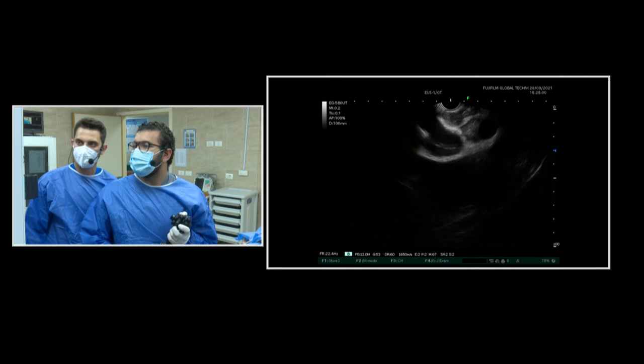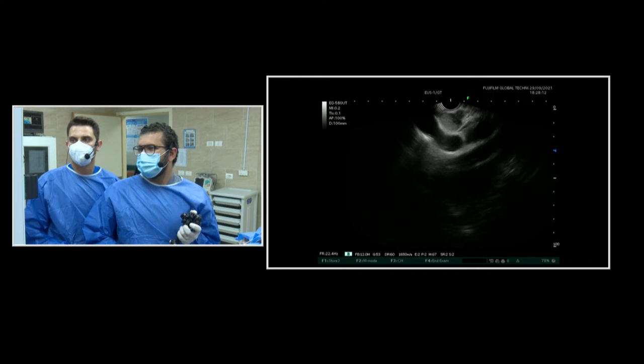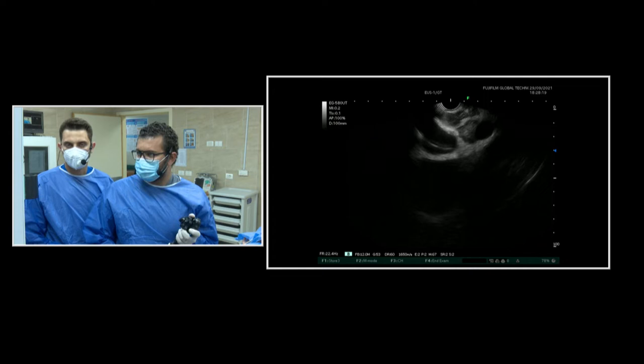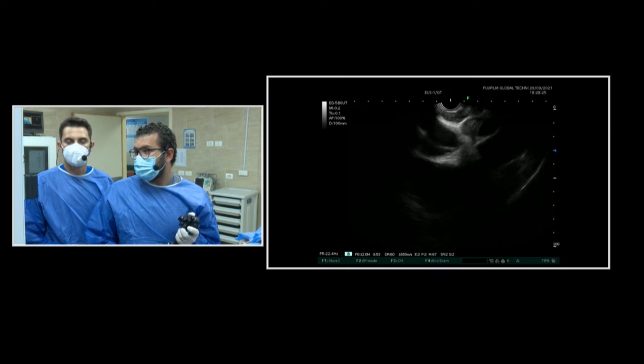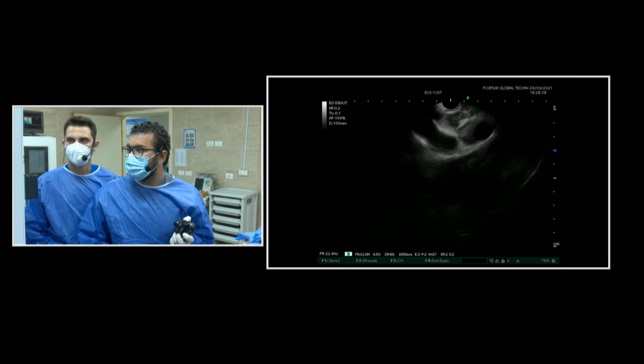Can we move a little bit slower, Dr. Yunan, so we can demonstrate the calcifications? The calcifications are the white dots that you can see inside the node — a sign of chronicity. Usually we find this in TB patients — tuberculosis — or chronic lymphadenitis. The most common cause is usually TB. And this patient has a very long history of chest problems, maybe it's related, maybe not. The subcarinal lymph nodes — this node is rounded, quite hypoechoic, but the node above is triangular with calcifications inside.